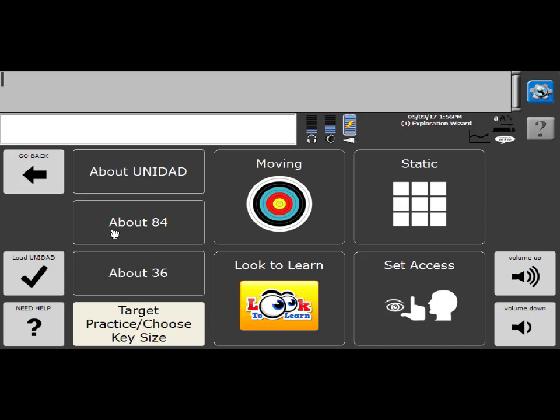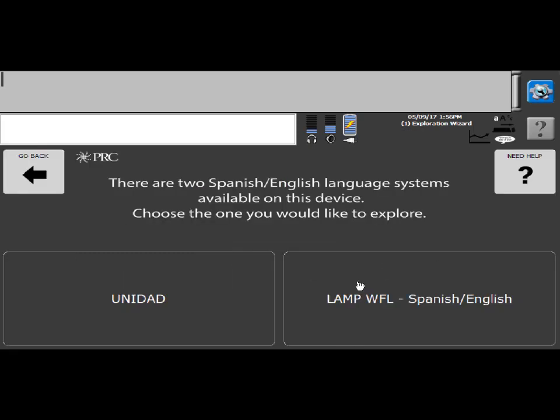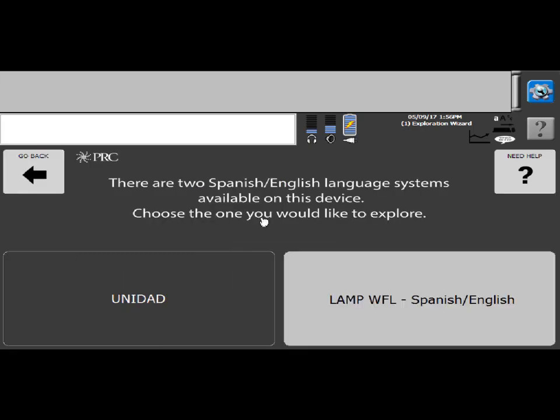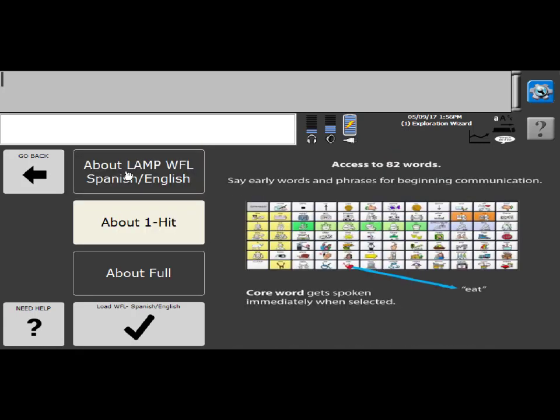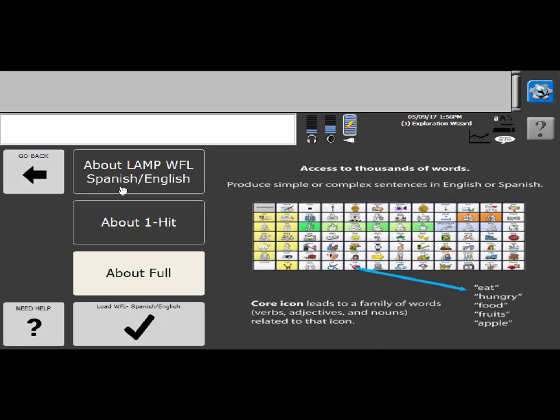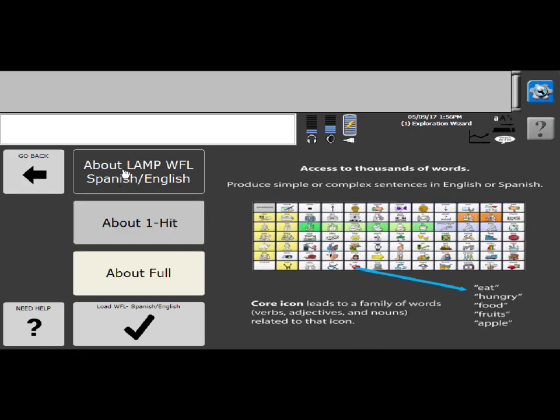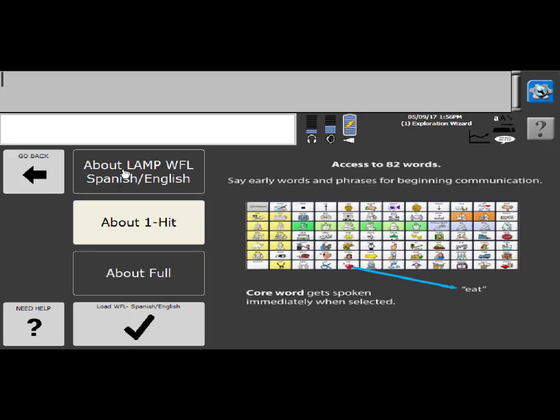But before I go to the load section of the Exploration Wizard, I'm going to go back and we'll take a look at Lamp Words for Life Spanish English. So in Lamp Words for Life Spanish English, you have a one-hit version as well as a full version. So in the one-hit version, when you select one of the icons, it's going to speak immediately and say the word eat. This is access to 82 words really for early communication, phrase building for beginning communicators.